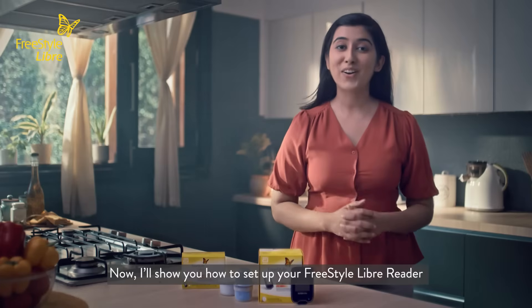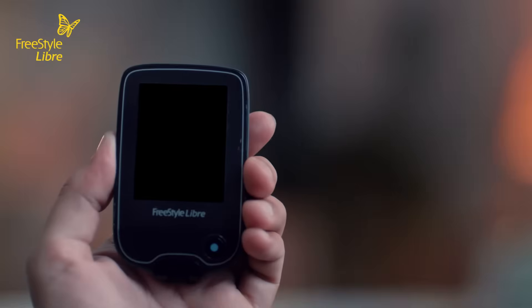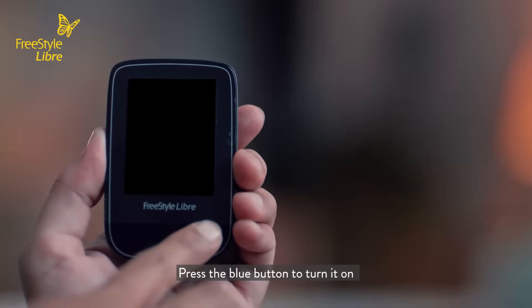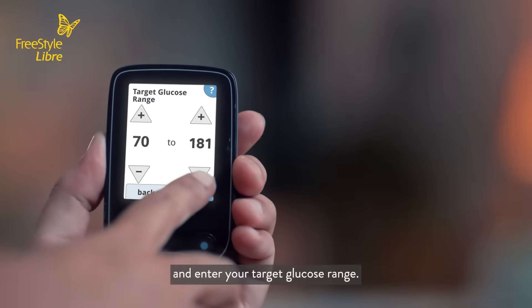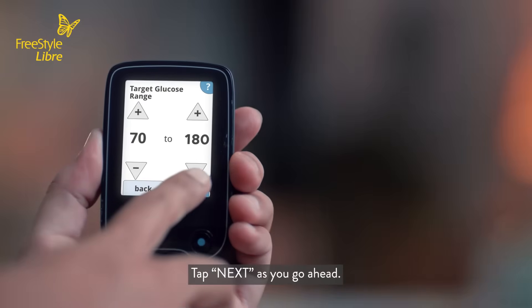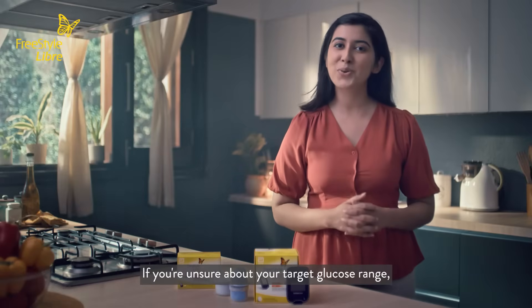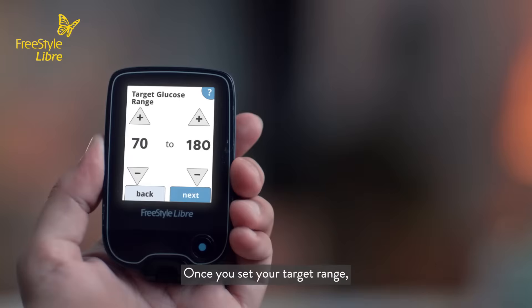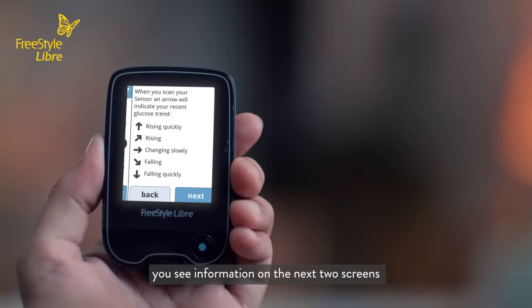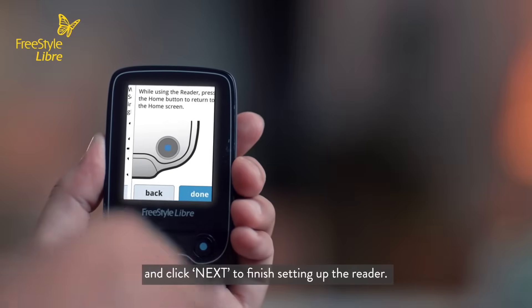Now I'll show you how to set up your Freestyle Libre reader so that you can scan and record your glucose profile. Press the blue button to turn it on, set the date and time, and enter your target glucose range. Tap next as you go ahead. If you're unsure about your target glucose range, your doctor will advise you as it is based on your individual needs. Once you set your target range, you see information on the next two screens that explains the glucose trend arrows. Click next to finish setting up the reader.